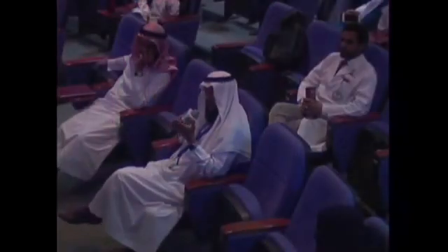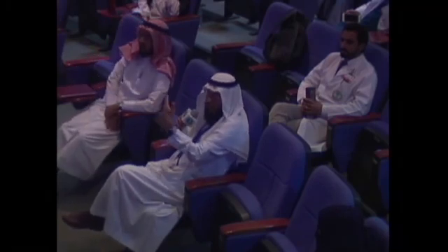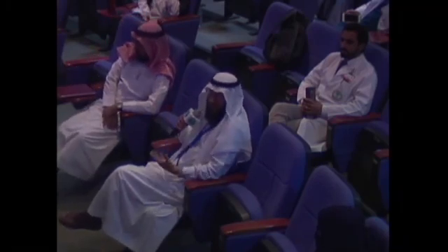Do you have a personal experience with the Kamra? Because now it is FDA approved. No. And this will preserve the binocular vision for distance. I have asked honest doctors who have used it, and even after hundreds of Kamras that they have implanted, they are not completely convinced and satisfied.